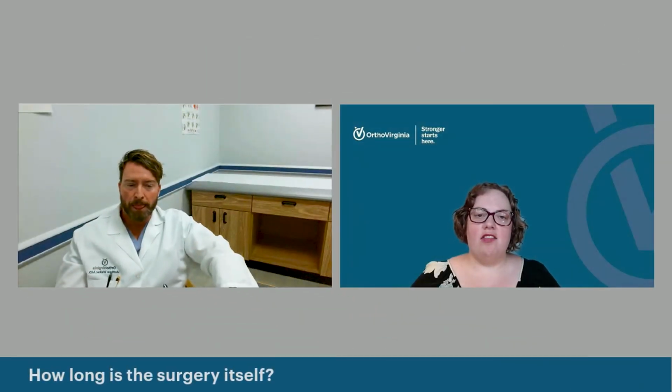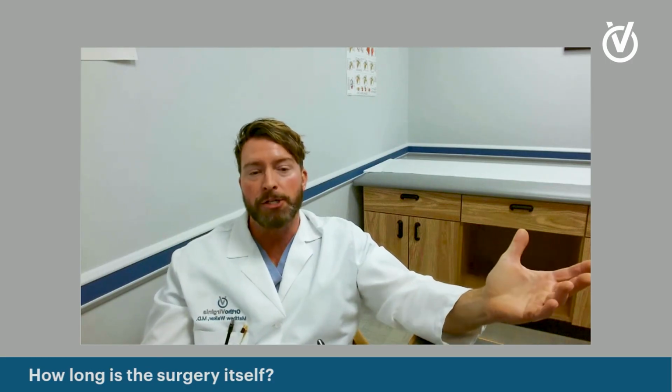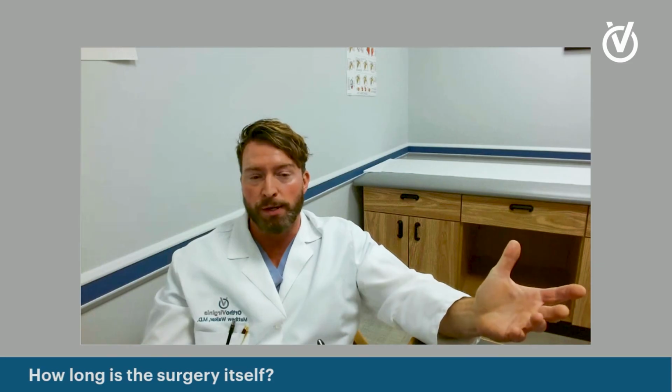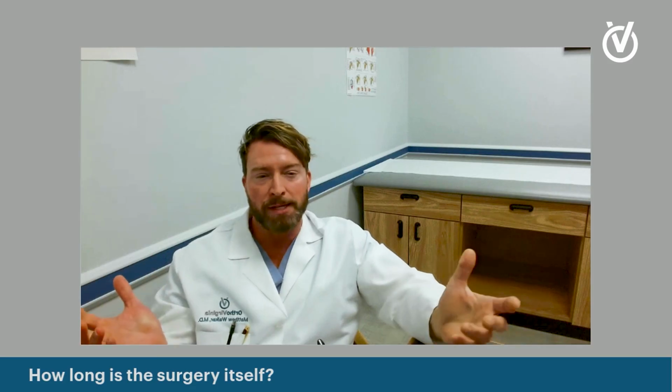Thank you. How long is the surgery itself? The shoulder replacement surgery depends on a lot of factors. One is how many shoulder replacements your surgeon does and how quickly they move through the steps. In general, I would tell you 45 minutes to an hour and a half for the actual operation.